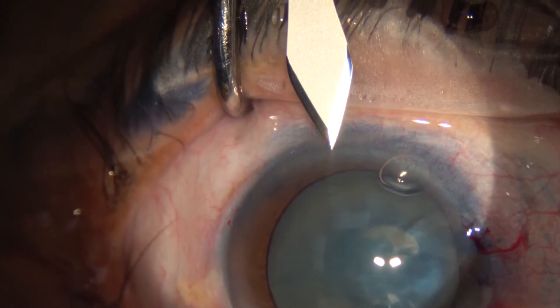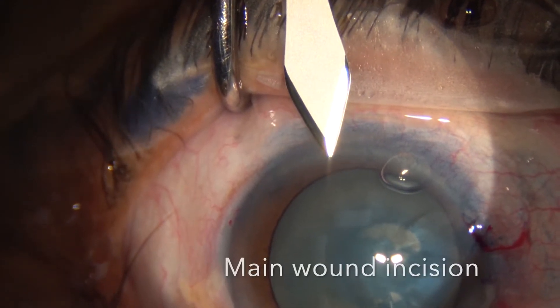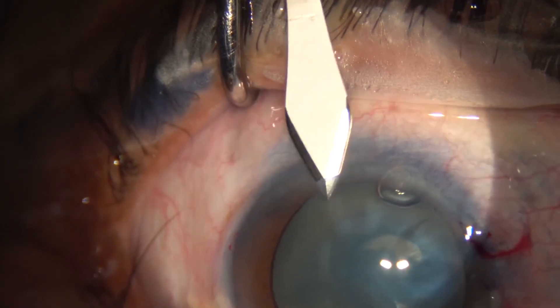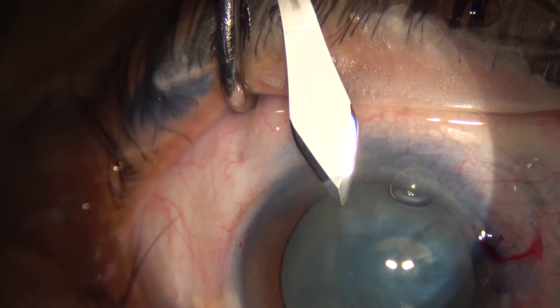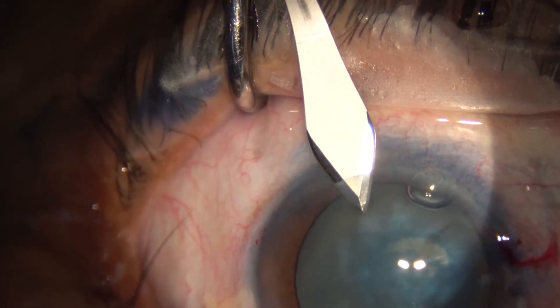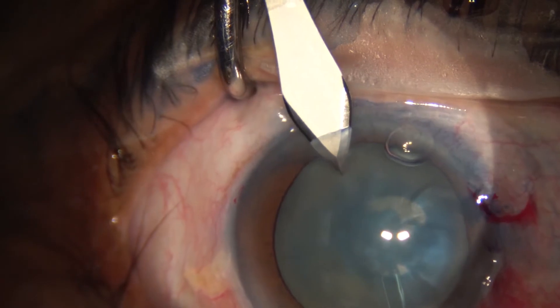Now we make the main wound incision, and after that we insert a 27-gauge needle to decompress the lens. This is important because it avoids any uncontrolled AC rent, which can lead to the complication we mentioned before — the Argentinian flag sign.